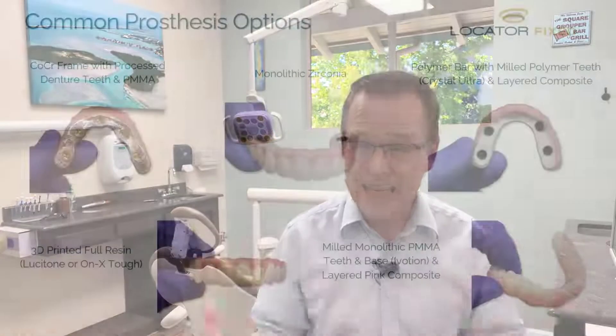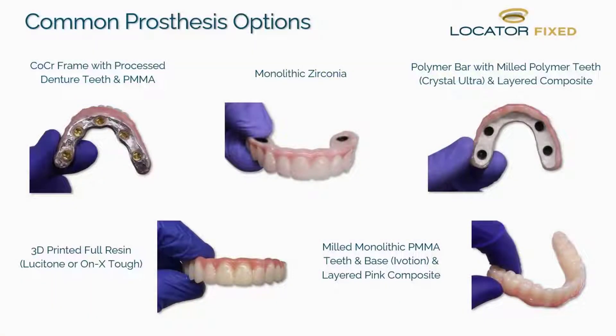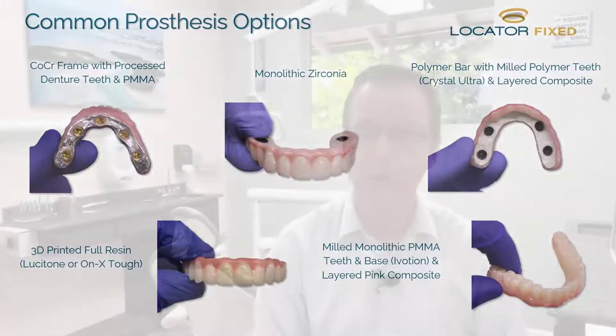Hey everybody, this is Dr. Michael Scheer coming to you from my dental practice here in California, talking a little bit about Locator Fixed — especially about prosthesis options for your definitive restoration. Locator Fixed is very similar to your existing screw-retain practice in prosthetic choice options. You can really use any prosthesis that you're utilizing for a screw-retain full-arch All-on-X restoration with your Locator Fixed.